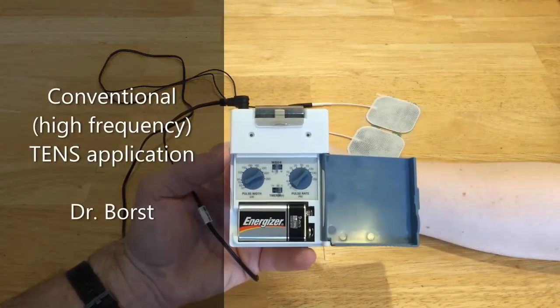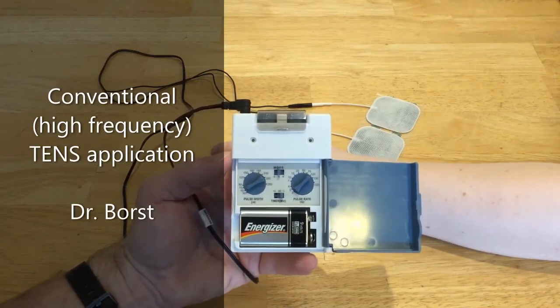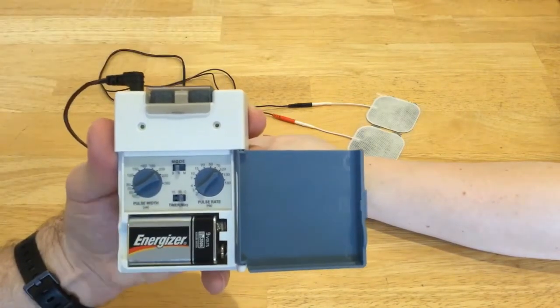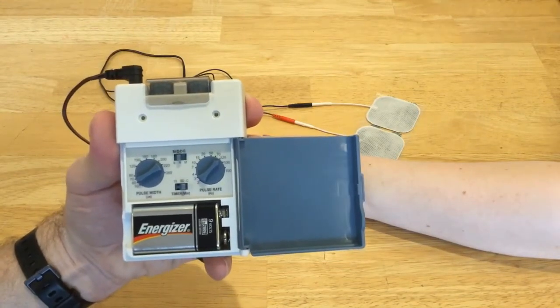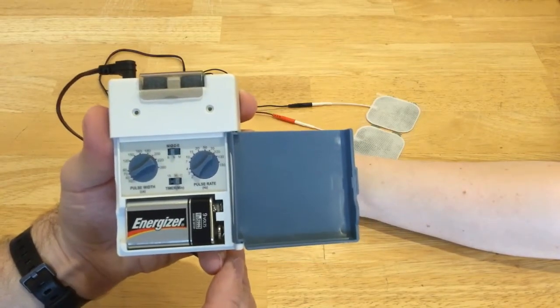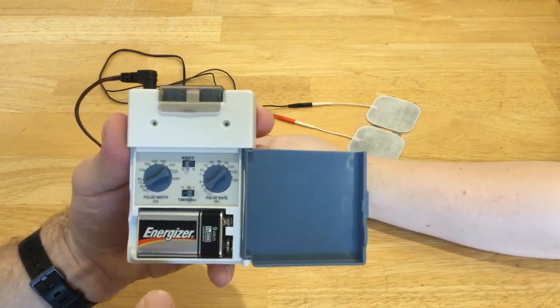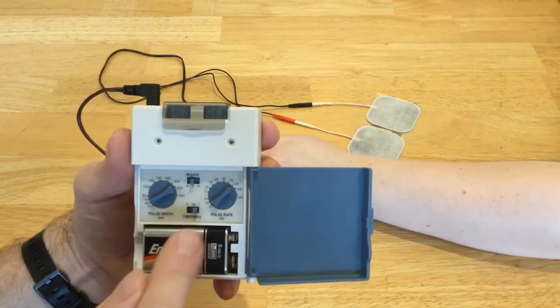In this video, I am going to demonstrate how to apply high frequency or conventional TENS. For conventional TENS, you want your pulse width or pulse duration set between 50 and 80 microseconds. You can see here I have it set for 60 microseconds. And you want your pulse frequency or pulse rate set between 100 and 150 hertz, or pulses per second. You can see here I have it set at 120.